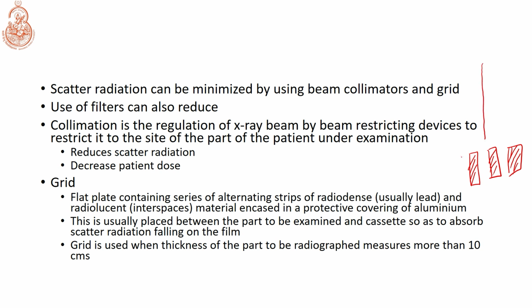When the X-rays pass from above, with the patient or the part placed over this, the grid will only allow the entry of those radiations which are passing in a straight line.